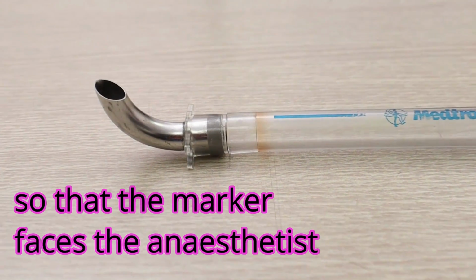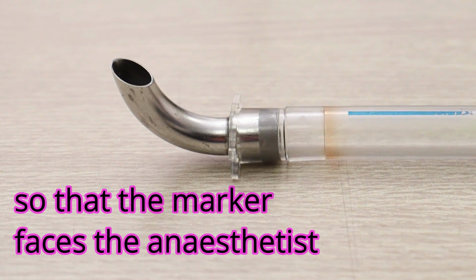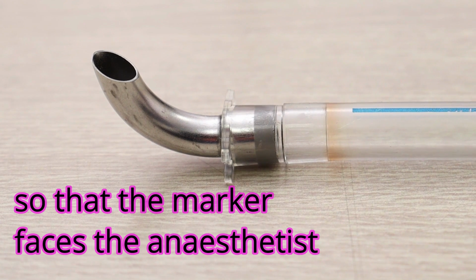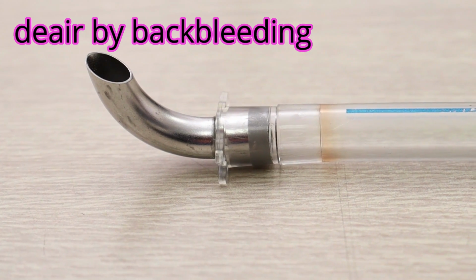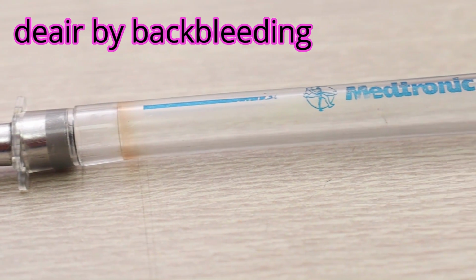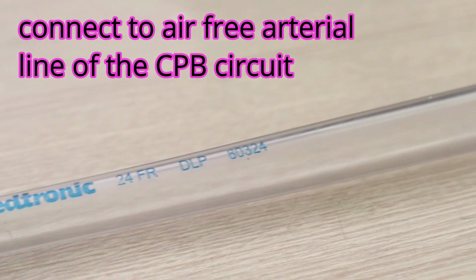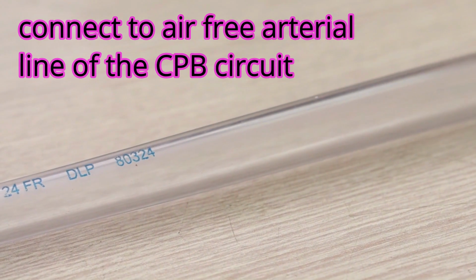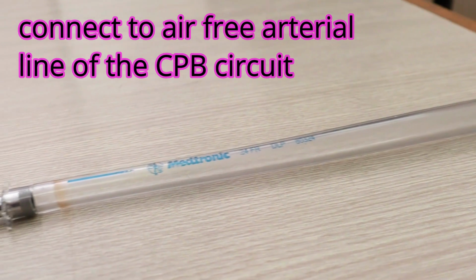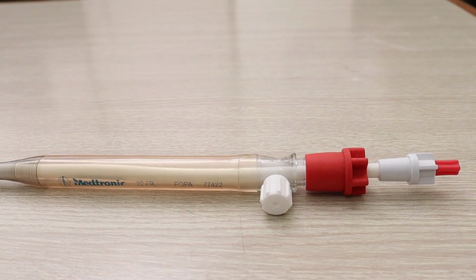And as you can see here, the beveled edge and the ID/OD ratio, you can appreciate in this particular image that a better ID/OD ratio will give you a thinner edge to the bevel, less gradient, higher flow. Now once the cannula is in the ascending aorta and with the help of the marker you are directing it towards the arch, you can release the clamp on the catheter which comes with the clamp. The nursing staff gives you the clamp, and then you can deair it and connect it to the CPB line, the arterial line of the CPB circuit.